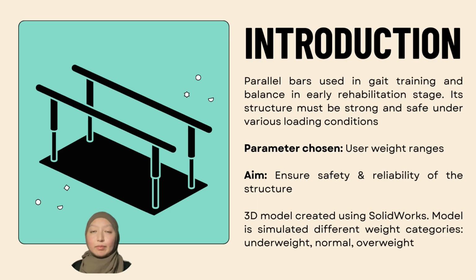the bar. A simplified 3D model was developed using SolidWorks to simulate how different adult weight categories such as underweight, normal, and overweight impacts the structure. These results were then compared with manual calculations to evaluate structural safety. This approach ensures our design meets clinical safety standards.